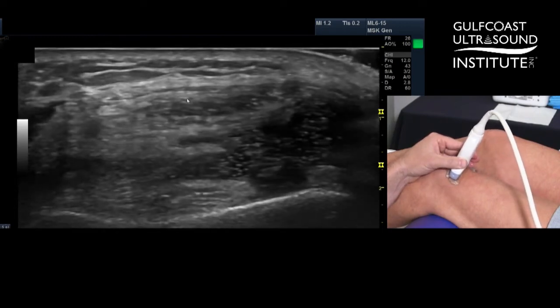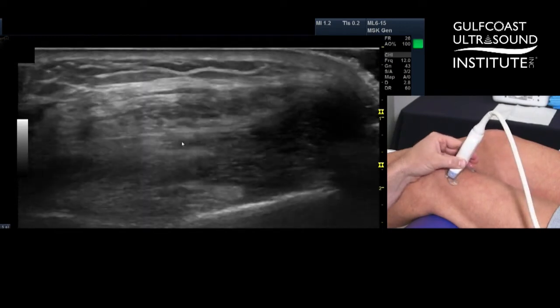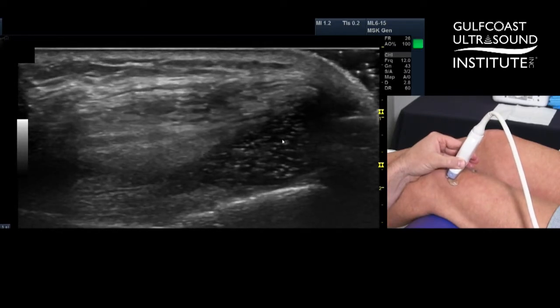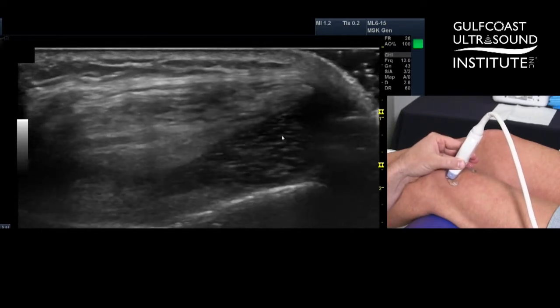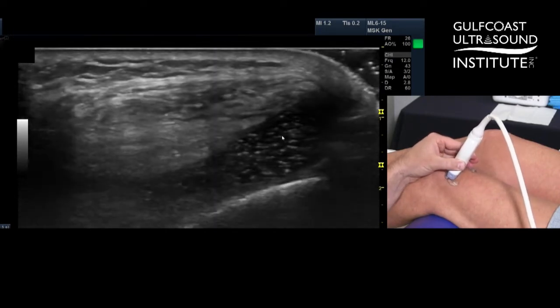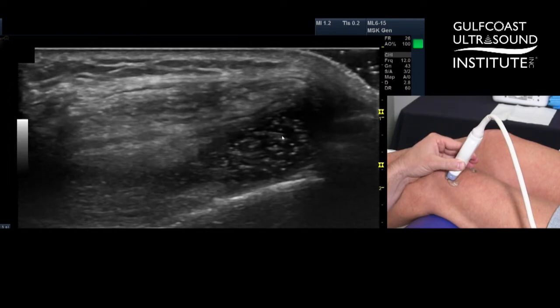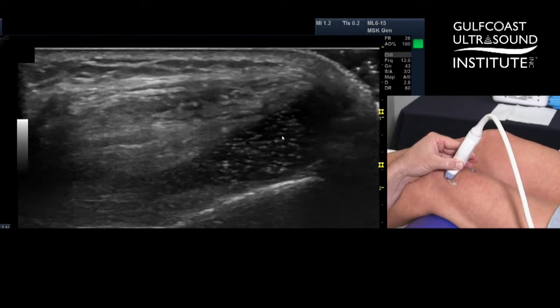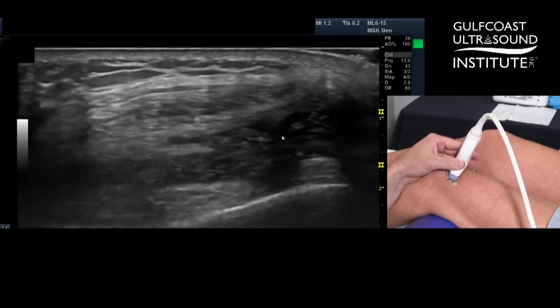This is the quad tendon here, this is the suprapatellar fat pad, pre-femoral fat pad, and then the joint effusion right here. These particulates may be secondary to the PRP injection we performed a few weeks ago. Otherwise you'd be thinking that's a pretty old nasty effusion that's been there forever and would come out looking like honey, but chances are I bet it doesn't come out looking like that — we'll wait and see.